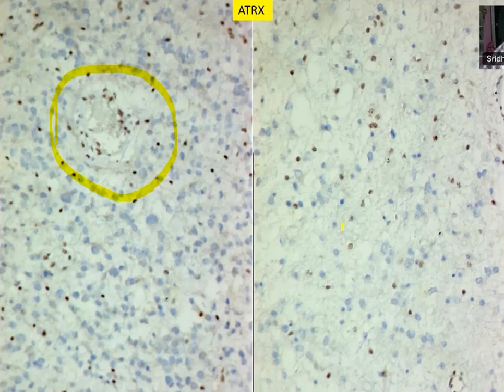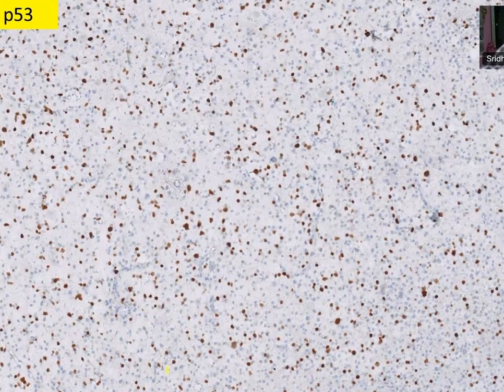So using immunohistochemistry for IDH, you could classify this into the molecular group, the CNS classification, as astrocytoma IDH mutant, using IDH and ATRX. Additionally, if you have anything, you can use P53.